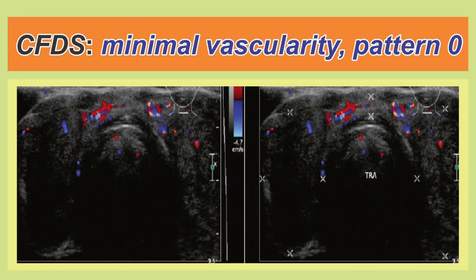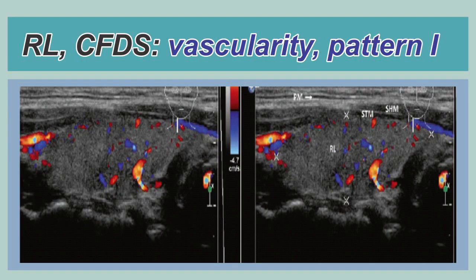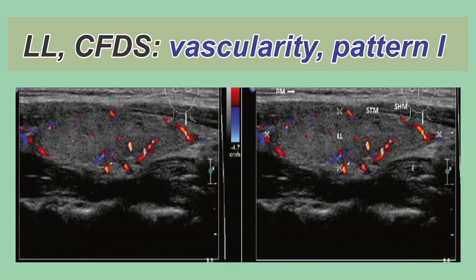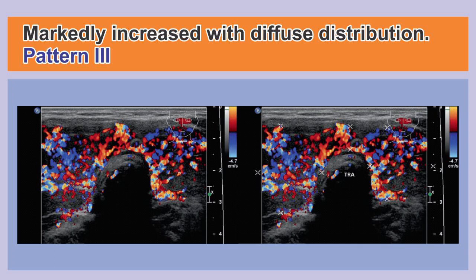Pattern 0 shows minimal vascularity with minimal spots in the thyroid gland. Pattern 1 shows patchy blood flow with uneven distribution — this can be seen in both the right lobe and the left lobe of the thyroid gland. Pattern 2 shows mildly increased vascularity with patchy distribution. Pattern 3 shows markedly increased vascularity with diffuse and homogenous distribution.